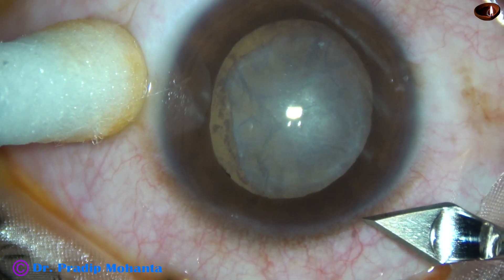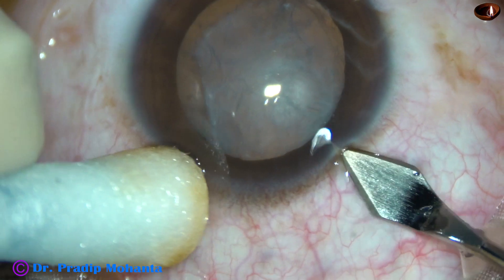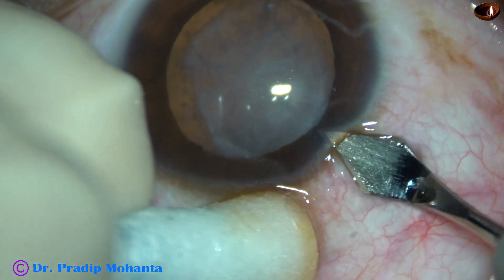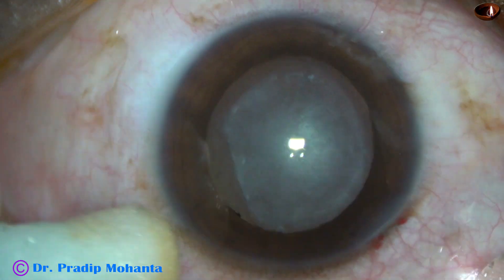The patient is a 22-year-old one-eyed man, and the patient is having retinal detachment. You can see a whitish glow — that is because of the retinal detachment.